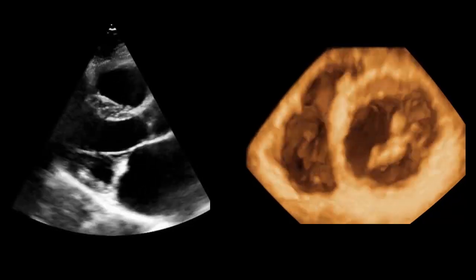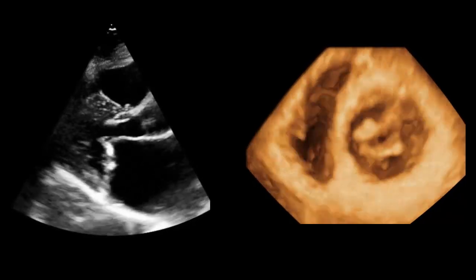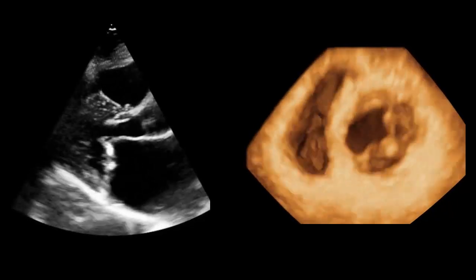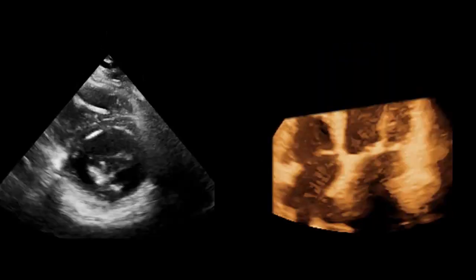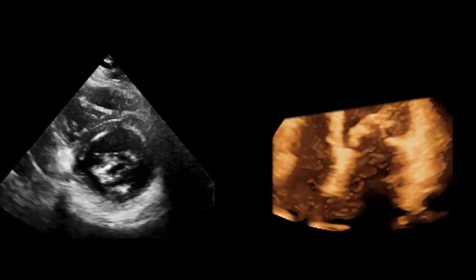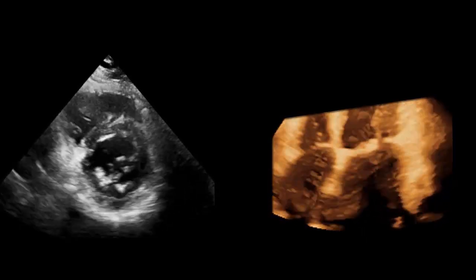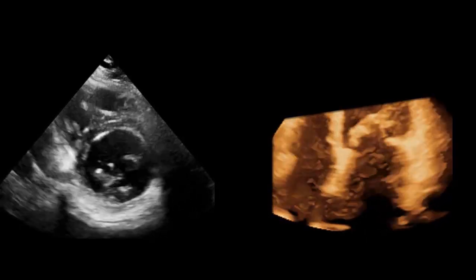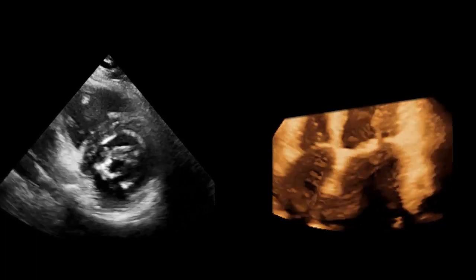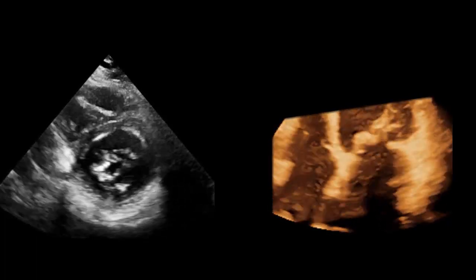Advanced transthoracic echocardiography is useful for diagnosing mitral stenosis. Indeed, 2D and 3D transthoracic echocardiography can evaluate the degree and mechanism of mitral stenosis, even in difficult cases.